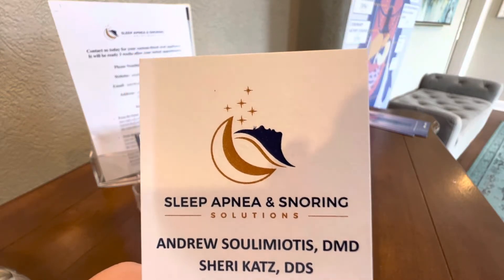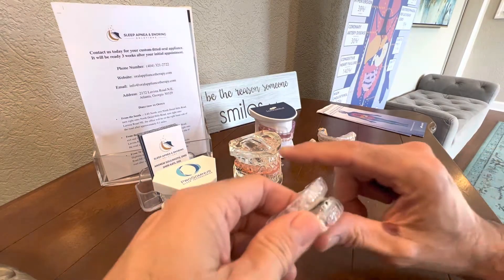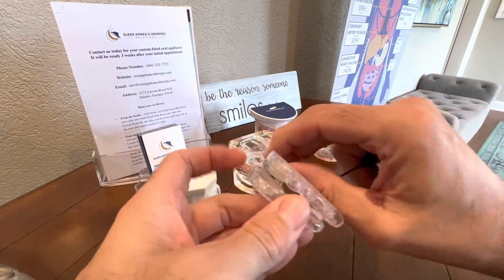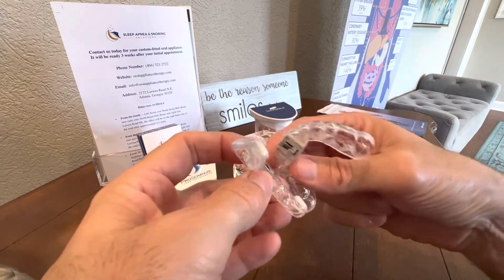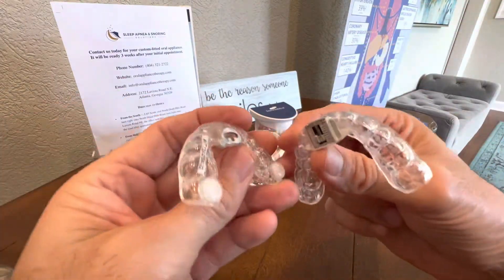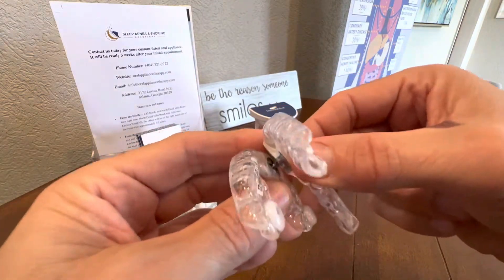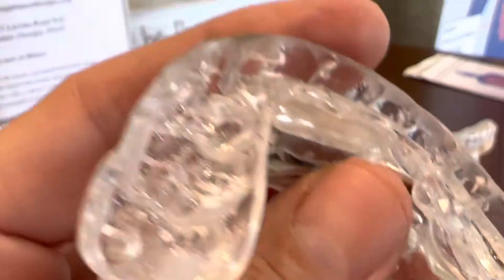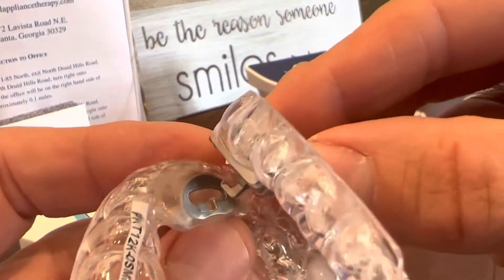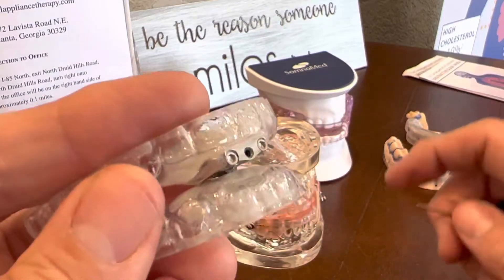Hi, I'm Dr. Andrew Sulamiyotis and we're going to talk about how we adjust or titrate a TAP device, or some refer to them as a TAP 3 device. If you have one of these devices, which basically has an anterior hook or a front hook, they'll look like this. These are on your top teeth and the way you engage them, you're going to hook them on the front just like so. The hook on the top teeth is engaged into that little slot or groove and you're going to bite into it and wear them, so they're going to hold your jaw forward.